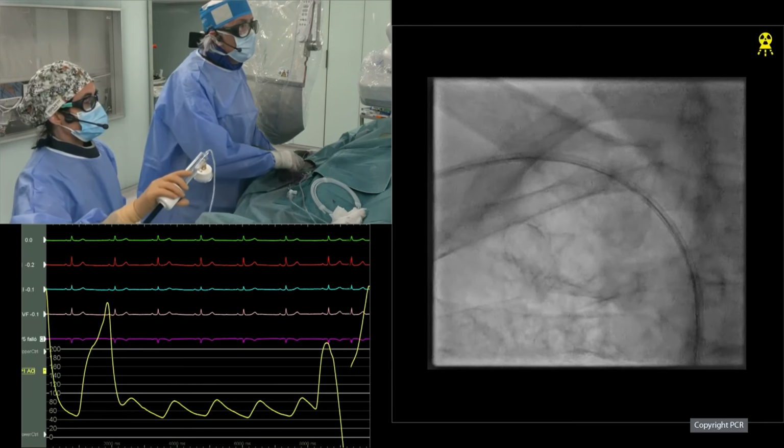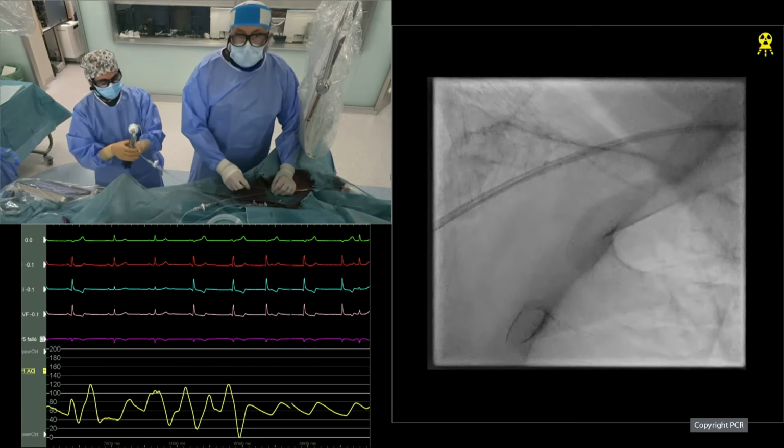But the interesting thing is that in bringing this second balloon, I'm noticing some obstacle very far away from the coronary arteries. So there might be some crisscross of wires. Yeah, it could be. It may happen. We try, of course, to avoid it, but here it is. Well, you can change the wire in the LAD. You do what you need to do.